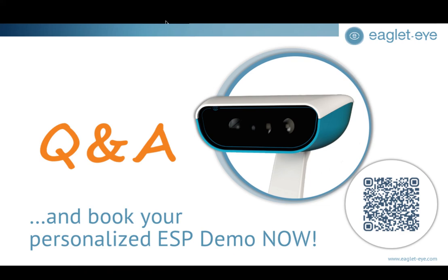I would say in our training with the ESP, I don't know that we're always asking practitioners to use numbing, because it's not really necessary, honestly. A lot of patients do just fine with no numbing. I do find, though, for some patients that are particularly sensitive, either from having discomfort or their eyes just water, that kind of fluid flow affects the quality of the images. The numbing will help with reflex tearing and just allow you to get the images that you need. But there's a lot of patients we don't use numbing on. In fact, a lot of patients we don't.